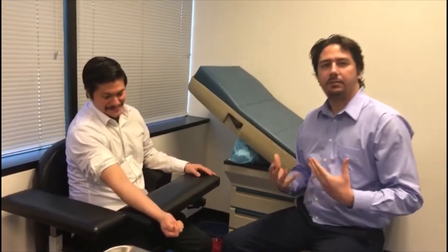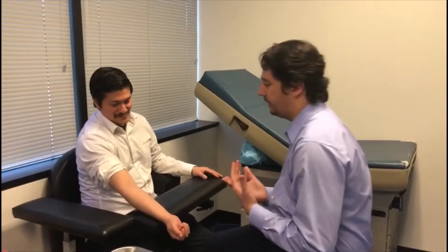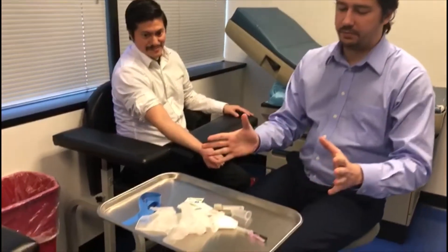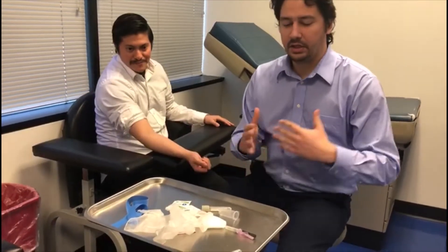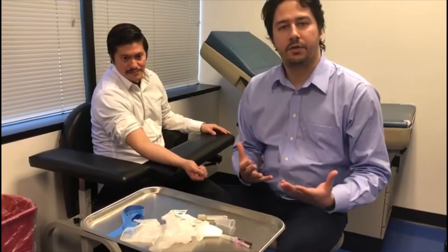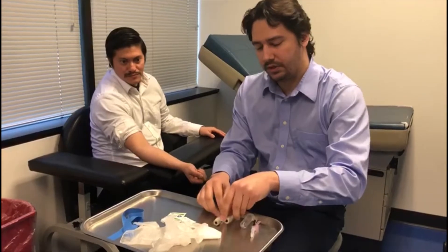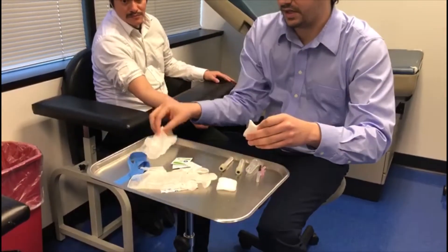Usually I don't recommend sitting, but just because of the video angle and everything else, I am going to be sitting to do the procedure. If you notice, my phlebotomy tray is all out of order right now — disorganized. Why? Because it's going to vary from person to person. For me, I like having everything nice and organized, pretty much the way that I am going to need it, nice and set up.